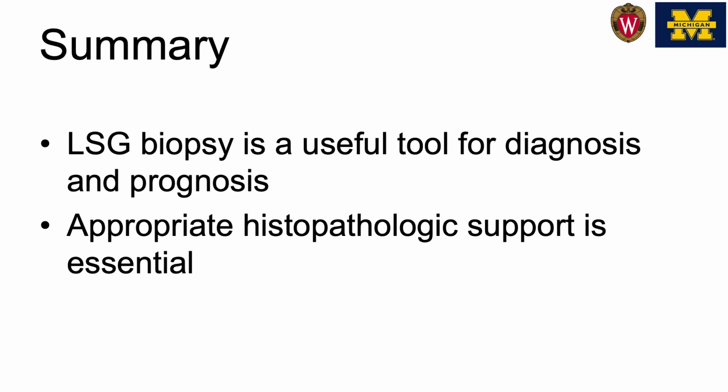So labial salivary gland biopsy is a useful tool for diagnosis and prognosis. And I would again emphasize that in addition to doing the procedure, which addresses a major gap because it becomes within reach of all practicing rheumatologists once you know how to do it, you also would need to find a pathologist who's familiar with interpreting these biopsies because they're frequently misinterpreted and also differentially interpreted.